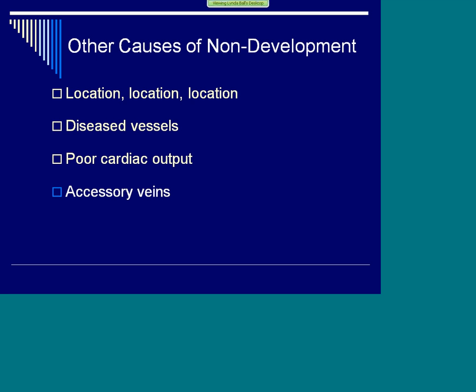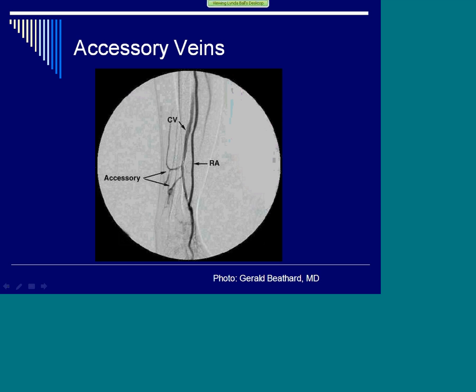Accessory veins. We will show you what those accessory veins look like. Right here, you can see this fistula here, and you can see these are offshoots. And these are pretty big vessels to be able to see and to recognize. What happens is that we require pressure to enlarge the fistula, and with these larger accessory veins, it bleeds off some of that pressure. So these are what we call the exit ramps. The blood just goes through and gets off at these exits here, and then it leaves less pressurized blood volume in those fistulas in order for us to develop those nice strong walls.